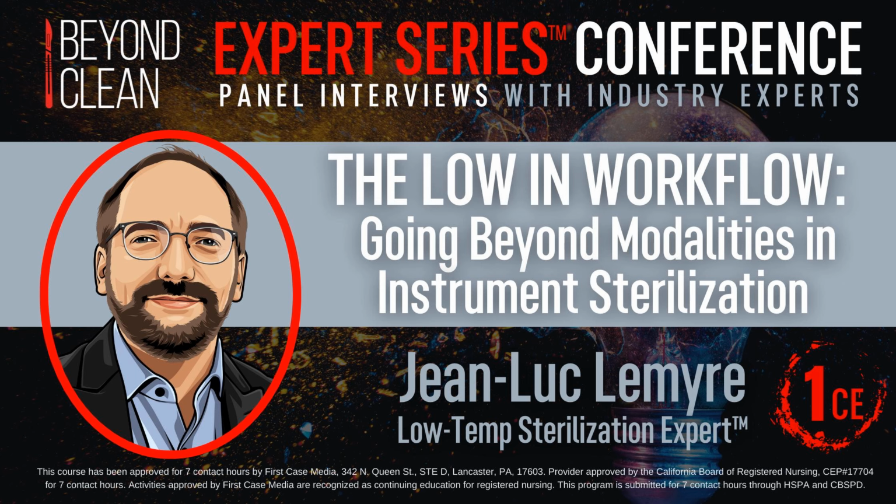Then peroxide, I mentioned, it's a liquid, but we want it in the gaseous phase. So it goes through a vaporizer that provides it with some heat to vaporize it. So you've got all of your peroxide molecules that stick together as a liquid that get freed basically, and now they can get into the chamber as a gas. So the goal is not to inject any liquid, but to inject peroxide as a vapor.